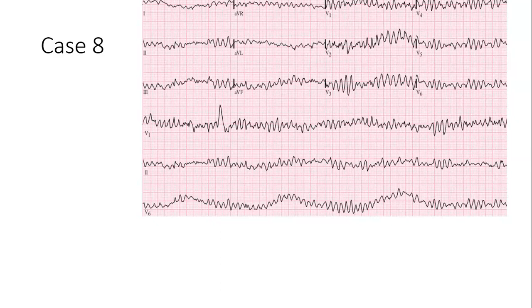I think I was asked this in the written when I wrote the DA, I think in 2016. These days, for the DA, they're incorporating it to be similar to a part one. So I'm sure something like this might come up in the current diploma now. So how does a defibrillator work?